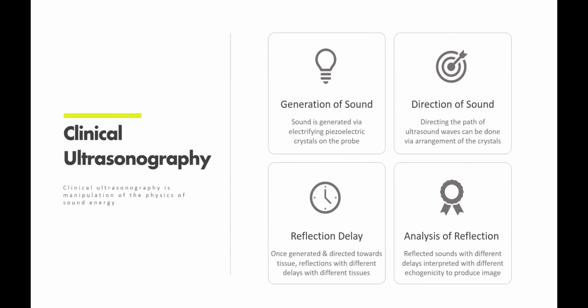Okay, so clinical ultrasonography is based on the manipulation of the physics of sound energy, the vibration energy. So not so much of the physiology of sound. It's more towards using the physics of ultrasound, physics of sound, manipulating it, and then translating it into clinical ultrasonography.